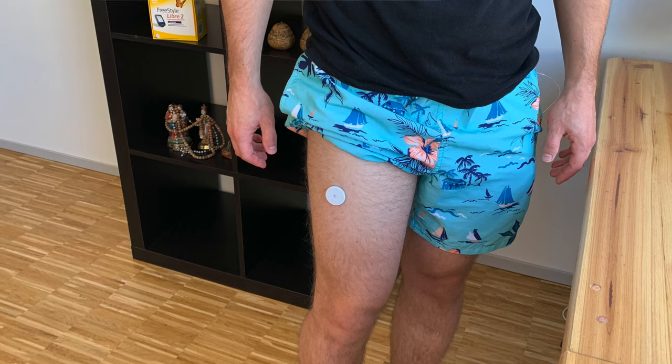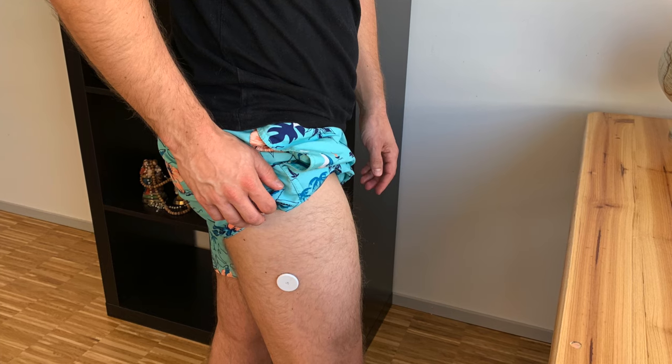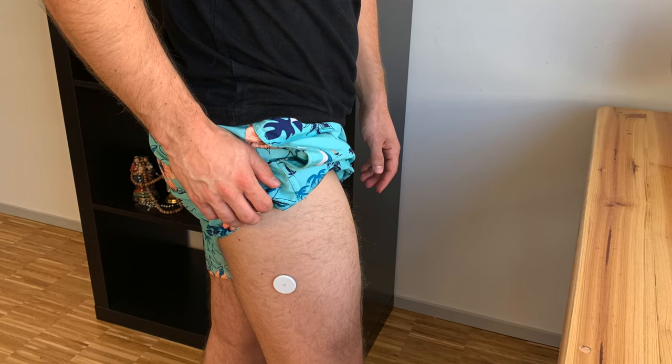Moving to my number 2 favorite spot, and this is the thigh. Thigh is so much more protected and the sensors I place there tend to last much longer. They typically show very accurate numbers — and not only for me. A clinical study showed that thigh is much more accurate than abdomen and almost as accurate as upper arm. For me, it's also very durable, discreet, and easy to cover even in summer with shorts or a swimsuit.